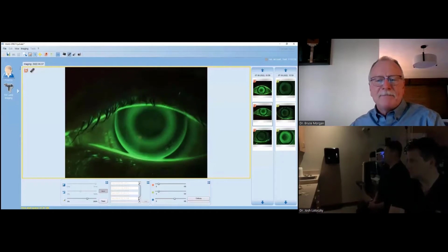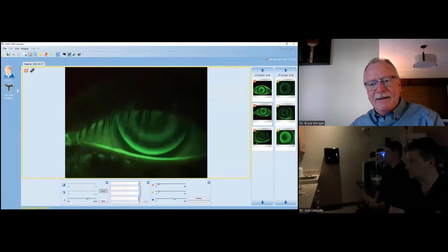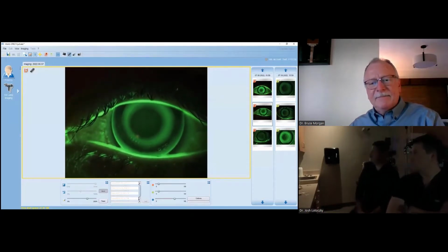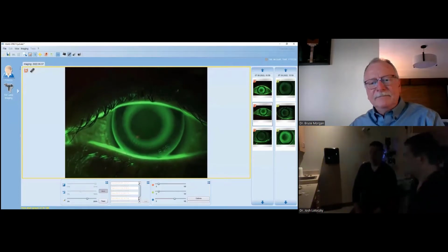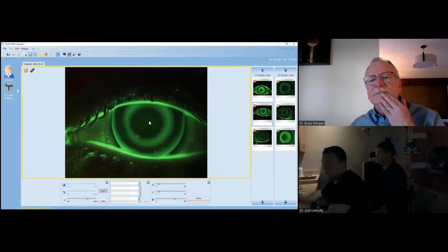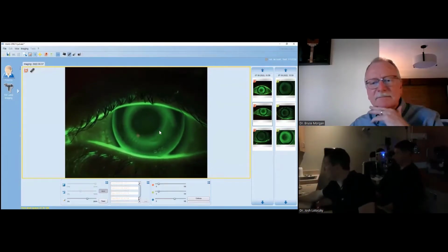So we're going to have her close a second, and then when she opens, it should come from the top, I would bet. Yeah. It's up there. This is one I'd be worrying a little bit about getting that smiley face in the topography. Yeah, it might be a little bit difficult to pick it out, but I'm trying to essentially draw around where her pupil is.